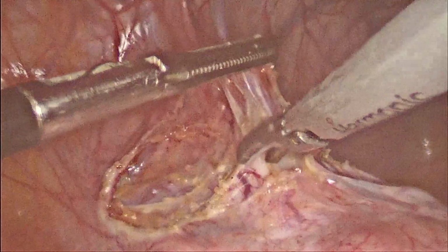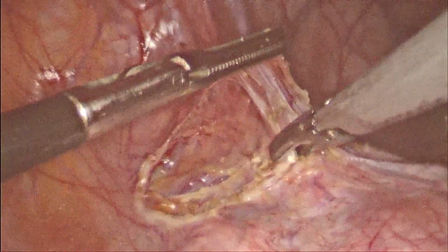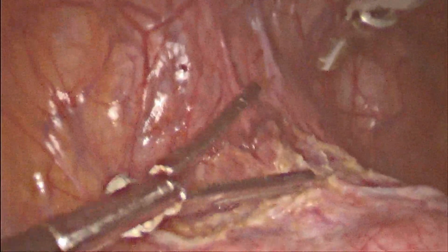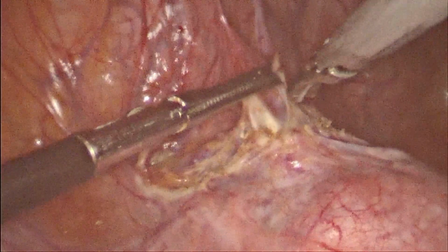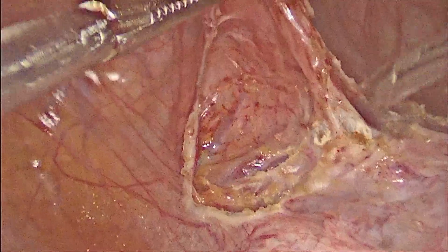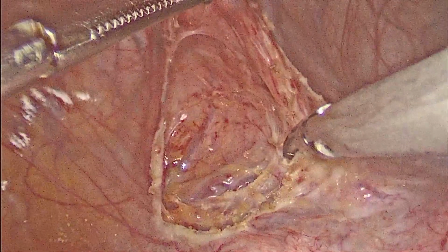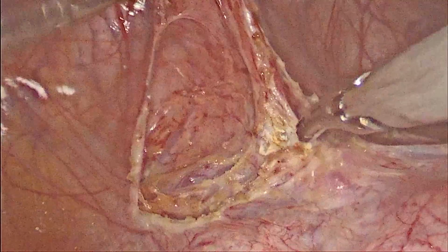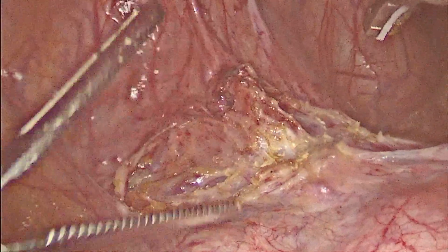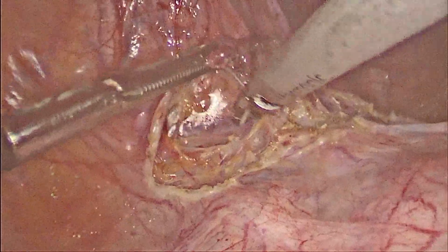We can see we are identifying fiber by fiber, identifying the bladder clearly. I'm holding the bladder in the left hand, lifting it up, identifying the dense fibrous tissue, and dividing only the fibrous tissue. It is being divided millimeter by millimeter. We are not taking a big chunk at a time, as inadvertently we may open the bladder in this case.